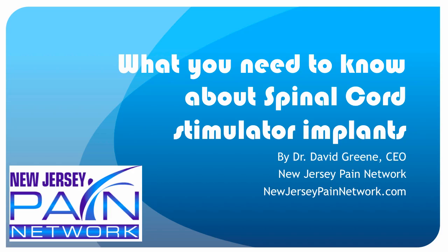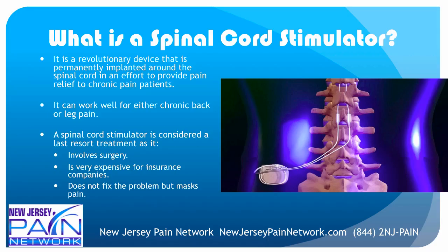Today's topic is what you need to know about spinal cord stimulator implants. This is a revolutionary device that is permanently implanted around the spinal cord in an effort to provide pain relief to chronic pain patients. It can work well for either chronic back or leg pain, or neck or arm pain. A spinal cord stimulator is considered a last resort treatment, as it does involve a surgical procedure. It's very expensive for insurance companies, and it doesn't fix the problem being faced, but it does mask pain nicely.